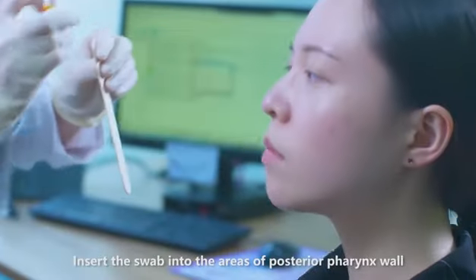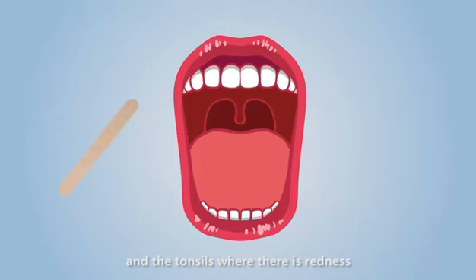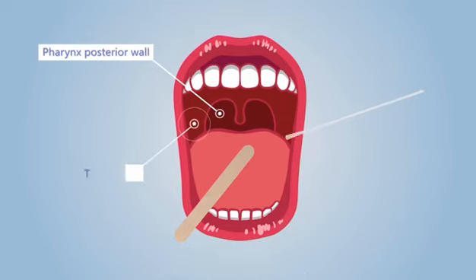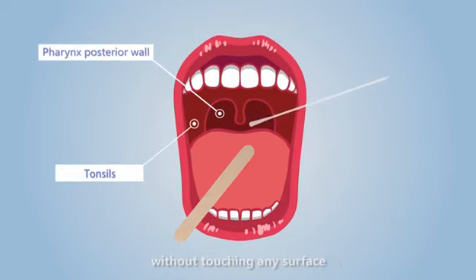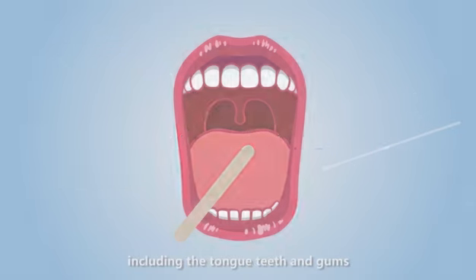Insert the swab into the areas of posterior pharyngeal wall and the tonsils where there is redness. Wrap the swab over the areas firmly and gently to obtain a good sample. Remove the swab from the mouth without touching any surface including the tongue, teeth, and gums.